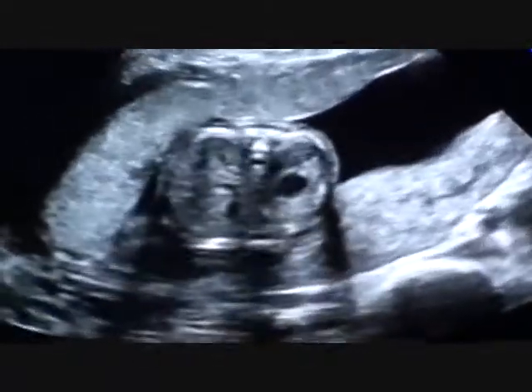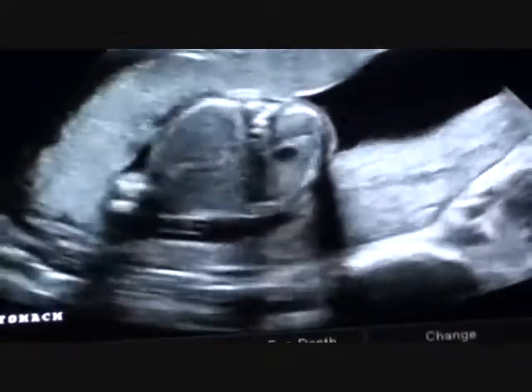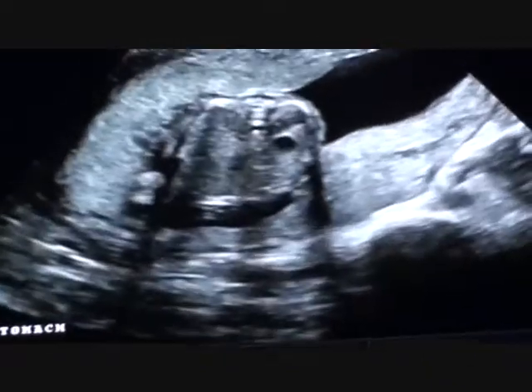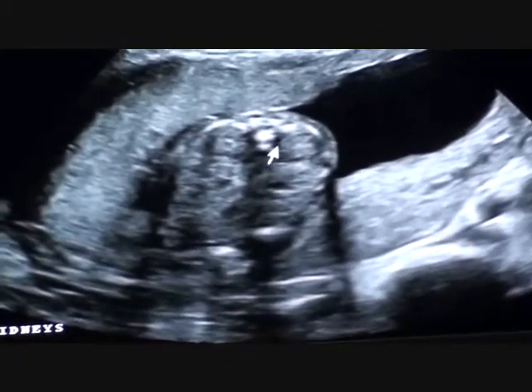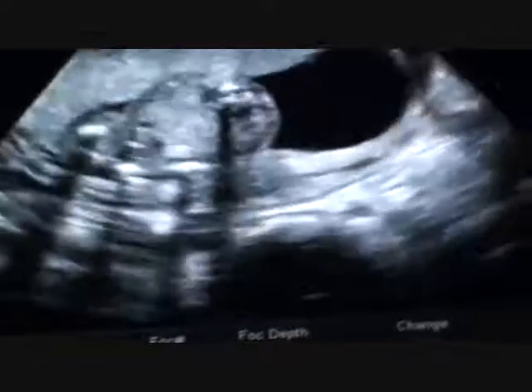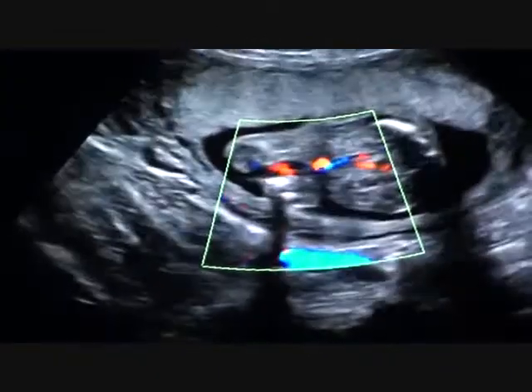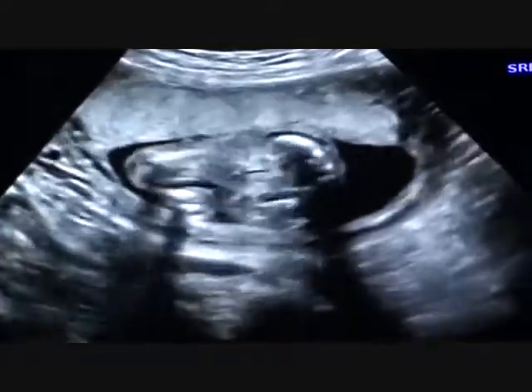Come back to the heart, picture the stomach. See we changed our belly — remember how we were up over there? We changed our belly. Stomach there. Kind of see two kidneys coming in — there's a kidney here, another kidney here, spine down the middle. There's baby's bladder — that is not too full yet. I can see the umbilical cord right here. We'll come back to that — need to wait for the bladder to fill. Still see his boy part down there.